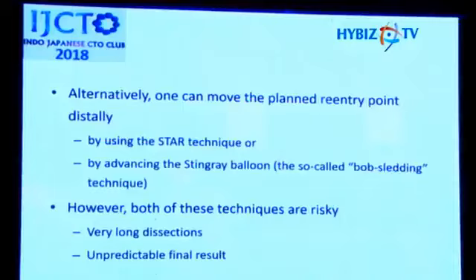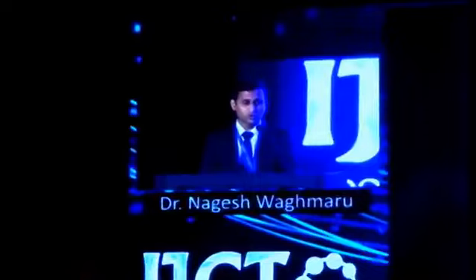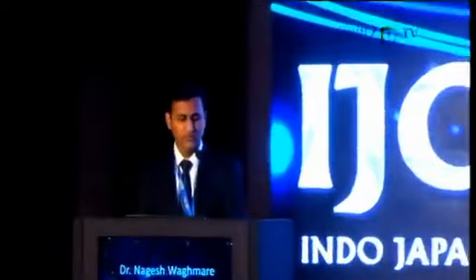Alternatively, one can move the planned re-entry point distally if we are not able to manage with the straw method, by using the STAR technique or by advancing the Stingray balloon itself distally, which is called the bobsledding technique. However, both of these techniques can be risky because they may create very long dissections, and studies have shown they may lead to unpredictable final results, as well as poor long-term outcomes. When the straw fails to rescue, people have gone ahead with the retrograde technique. So whenever we are planning antegrade ADR, if we are not able to manage a subintimal hematoma, we should be ready for the retrograde approach also.